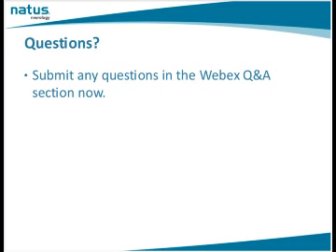Now, where this gets hard is when a patient is on a ventilator, and that's just difficult. If the patient isn't on a ventilator, but you keep getting the strong respiratory impulse, you could ask the patient just to stop breathing if they are able to cooperate for a moment, and that will allow you to get a better signal.